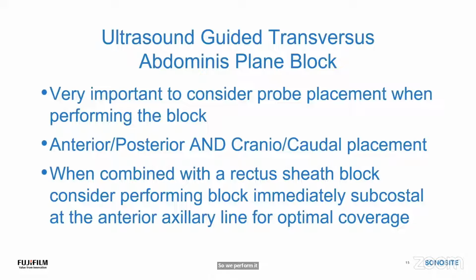I never know where the surgeons are going to put the ports. Okay, I could stare at them every single case I do, and I can never figure it out. There's always one that I would have never guessed. And so I want to get as much purchase on the abdominal wall as possible so that if I have one robotic port or a drain site that's not covered by my blocks, I don't feel horrible afterwards because really we haven't done any justice for the patient at that point.